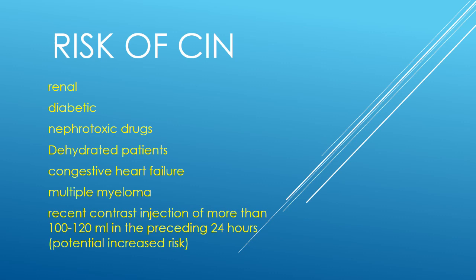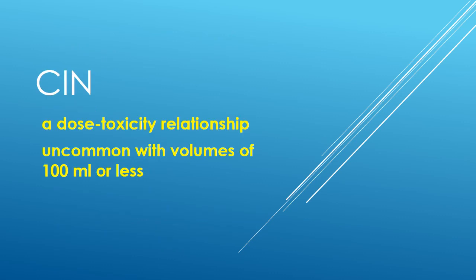So I would strongly recommend that in case a patient has undergone a contrast CT study, wait for a day. Wait for a day and then you can give more contrast and do a contrast study of a different part. This is because contrast-induced nephropathy is a dose-toxicity relationship, and it is very, very uncommon with volumes of 100 ml or less.